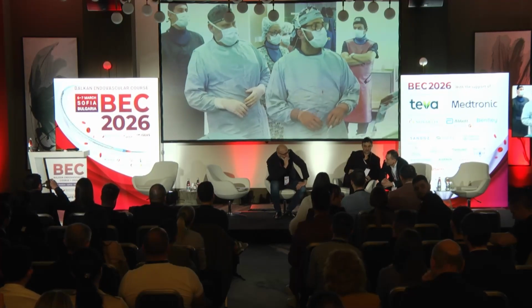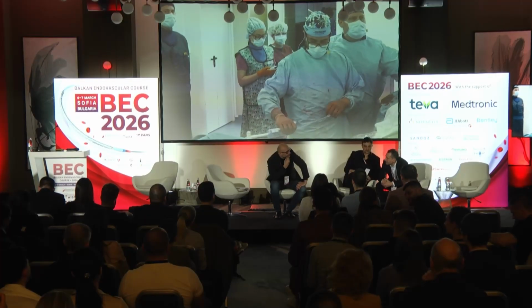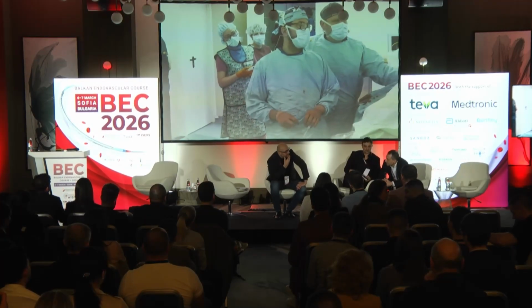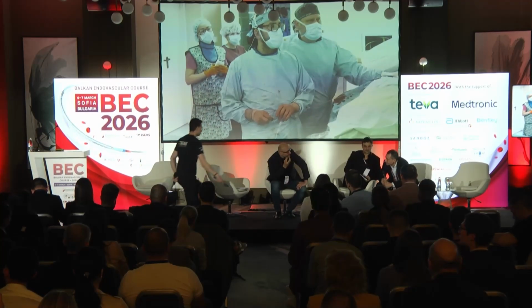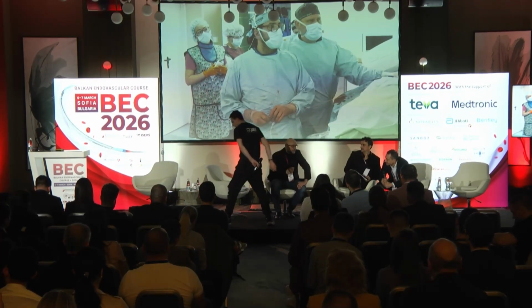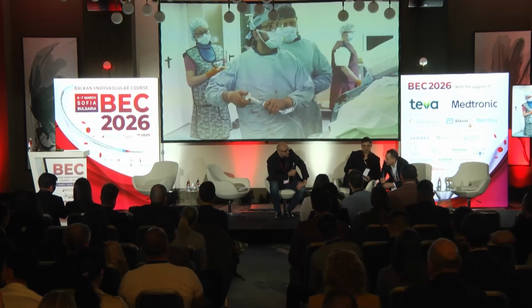It's better, of course. In some cases, I haven't used Zilver. Also some Optimed stents. Optimed is very good for radial force. But it's a question of money.